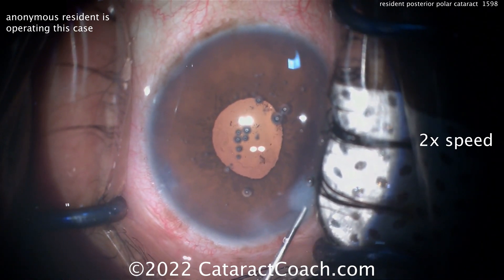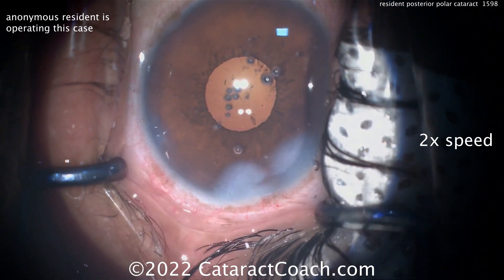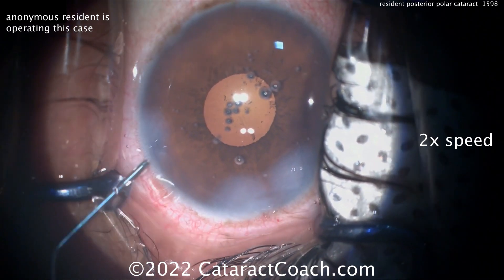Here at the end, get a nice good seal there — and that looks like a great case, beautifully done, young doctor. I appreciate that, and thanks for understanding. We do keep all resident cases anonymous. I know you wanted your name mentioned, but trust me, it's better anonymous when you're a resident.